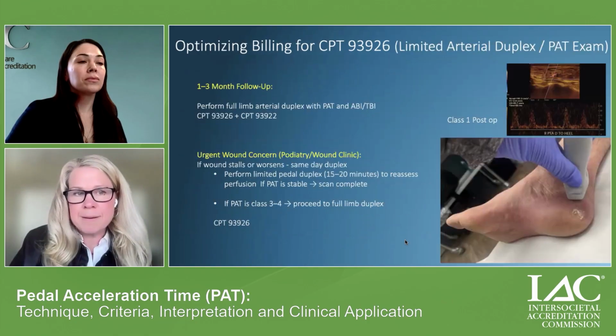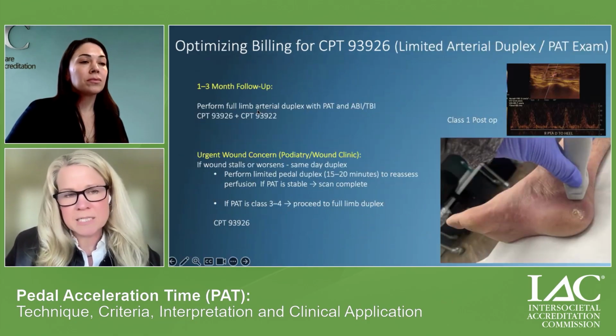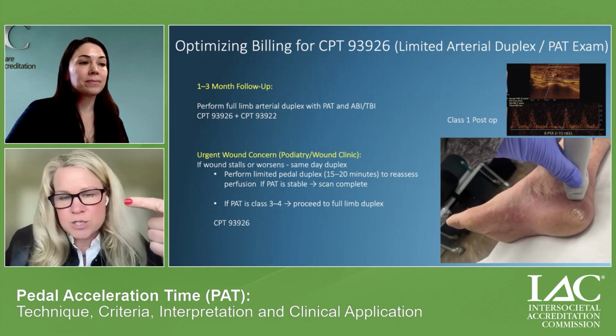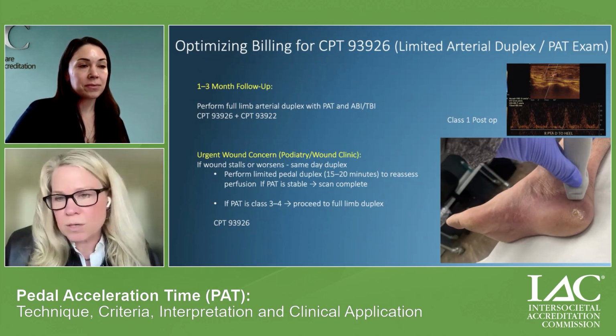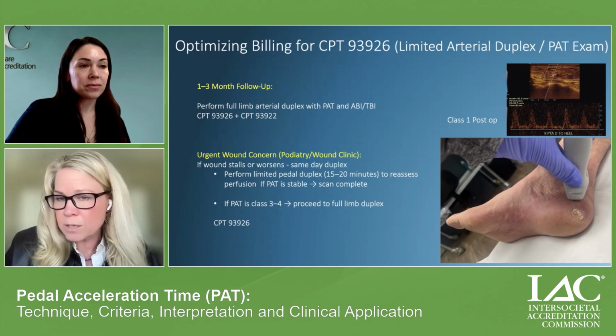Then when the patient comes back for their 1 to 3 month follow-up, we definitely need to do the full arterial duplex, especially if there are stents or if there's a bypass. You want to make sure there's no in-stent stenosis or distal anastomosis stenosis. So we can't lose sight of that for sure.